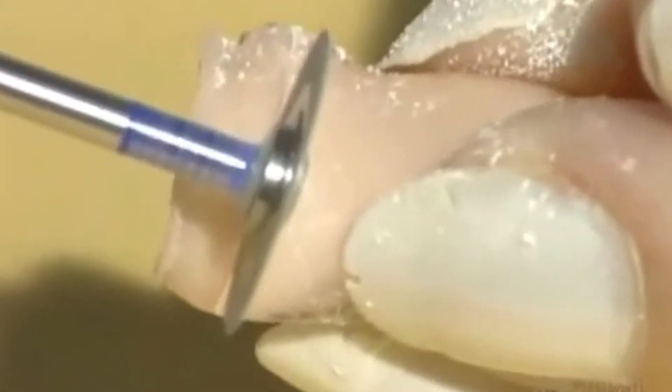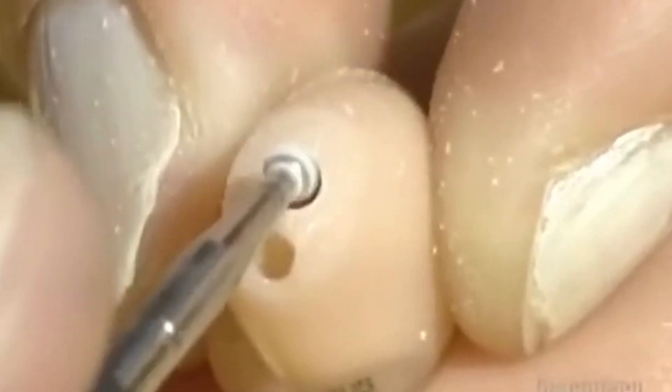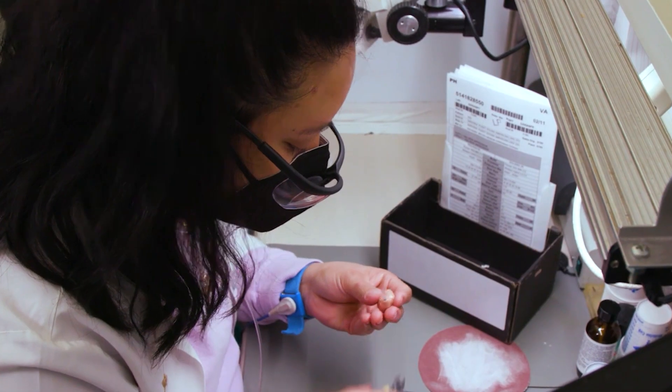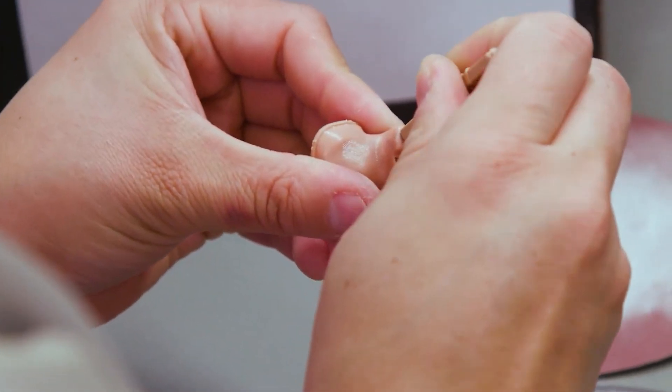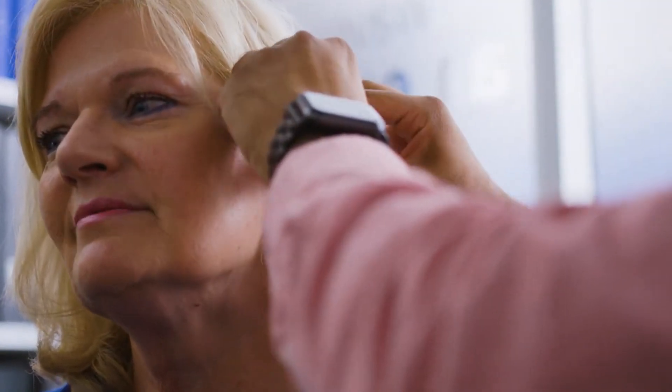After the acrylic shell is prepared, a technician grinds off the excess flanges from the shell. He will then add a vent or opening — a small piece of silicone wire shaped to the vent size is run through the inside of the shell and pulled out. The technician drills holes into the canal end of the shell for the receiver tube. After that, the outside of the shell will be buffed to a smooth, shiny finish. A technician will size the shell for a faceplate or flange — the area that will be exposed outside the ear canal — using the vacuum form from the original impression. The plate will be carefully set at the correct angle for the user's ear.